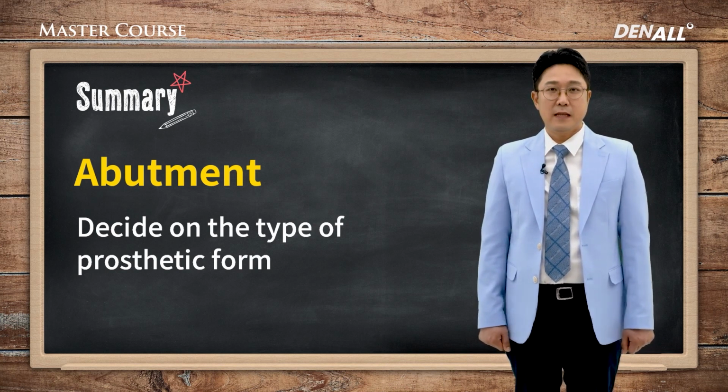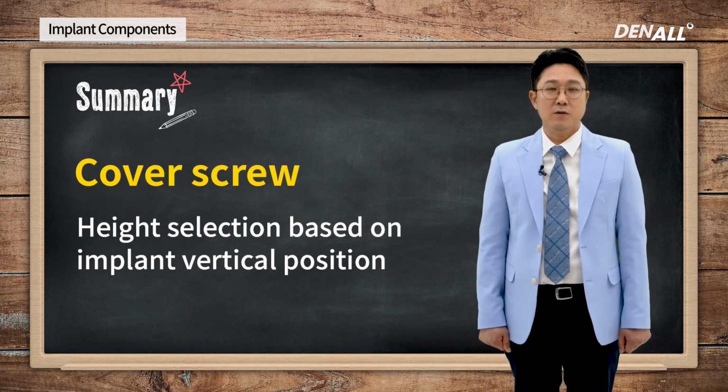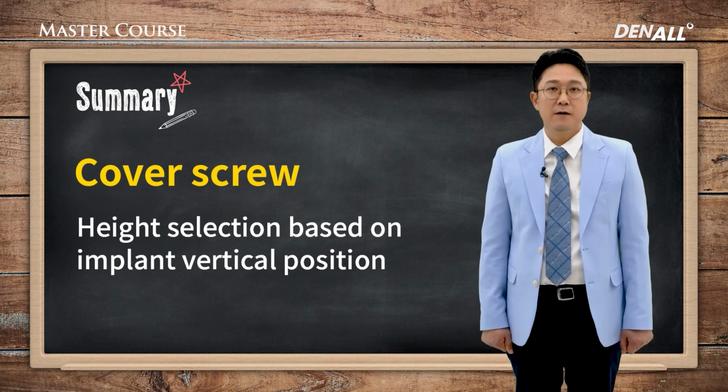Next, let's look at abutment screw, which connects the fixture and abutment strongly. During healing period for osseointegration, cover screw protects the internal structure of fixture, and depending on placement depths, there are different specifications related to cover screw.